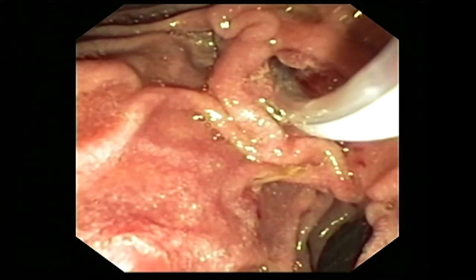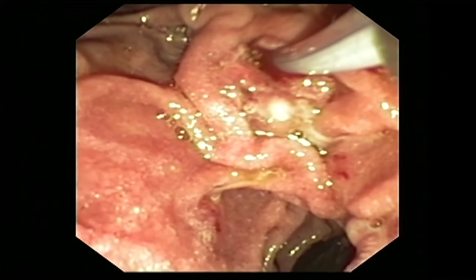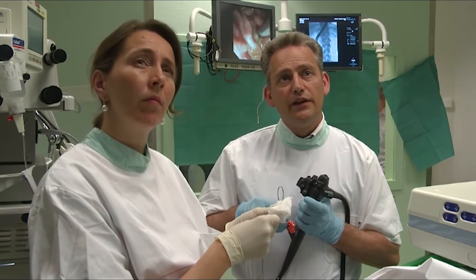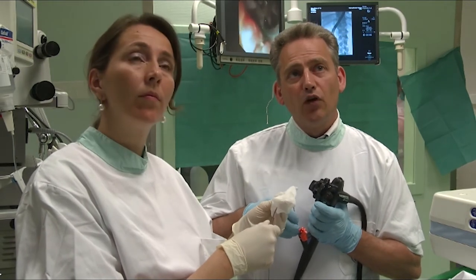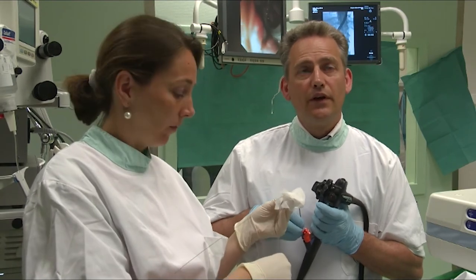Try to get an accurate position. Do the recannulation. And then we will pass the wire across the stricture. So the guide wire is now passing the stricture. It's going into the liver hilum. I will follow now with the catheter. I will introduce the catheter all the way up to the liver hilum to make a nice cholangiogram.